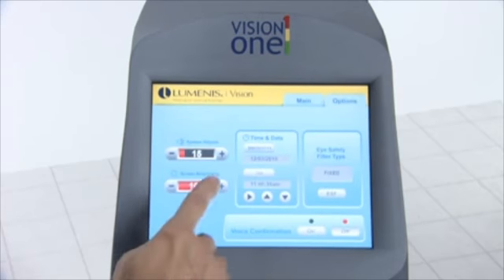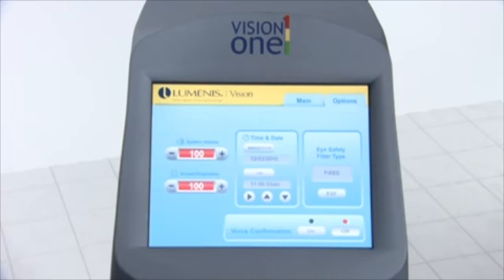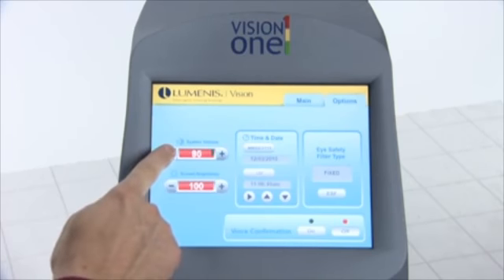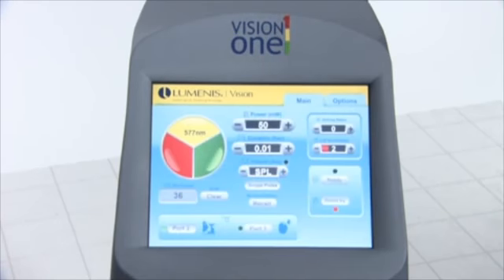To adjust the volume of the user interface audible indicators, press the Options tab to view the options screen. Next, press the Plus, Increase, and Decrease selectors in the System Volume field to select the desired volume. Then, press the Main tab to return to the treatment screen.